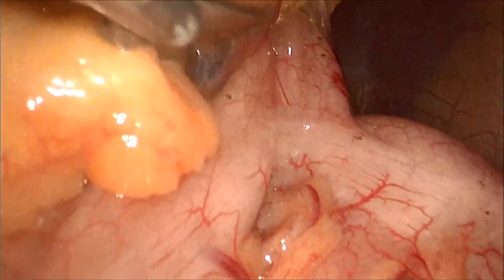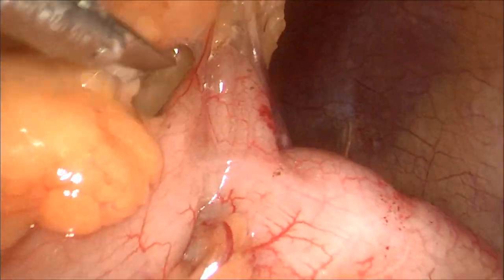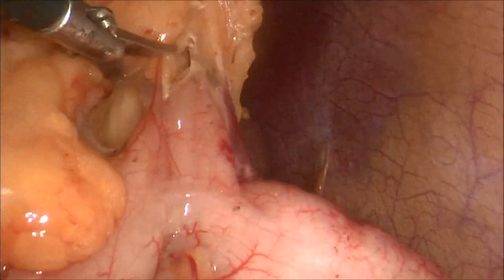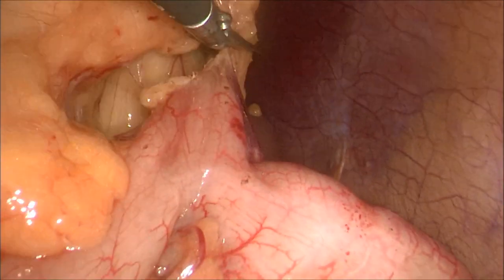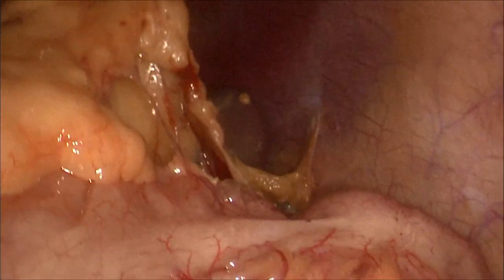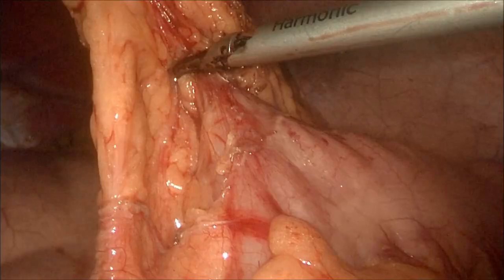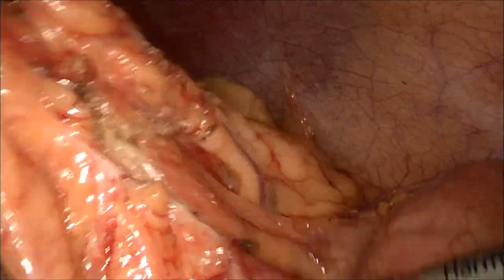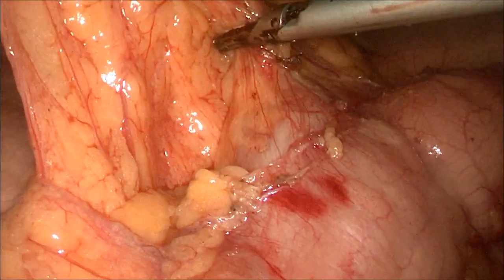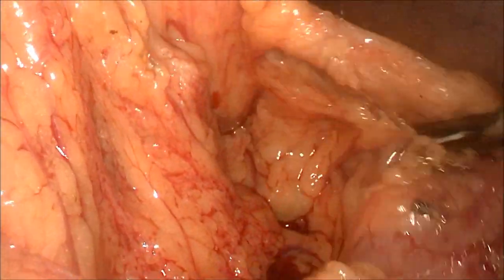The transverse colon from the level of the mid-transverse colon till the splenic flexure is also dissected free from its omental attachments so that it can be easily delivered into the midline wound.